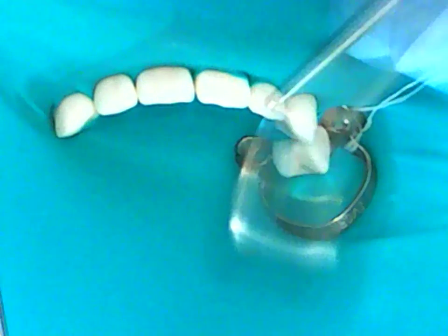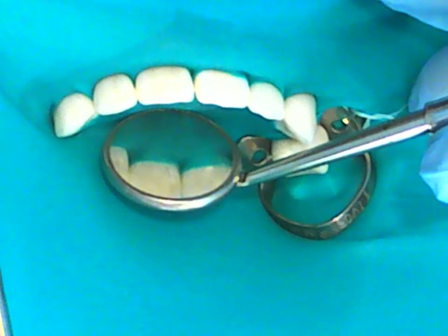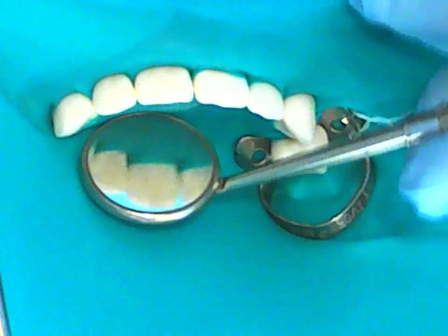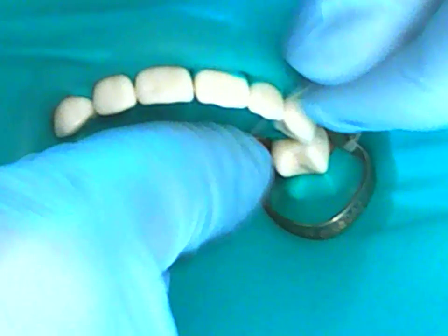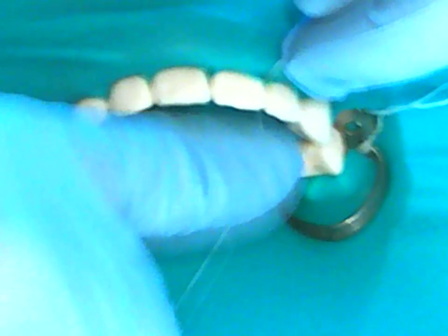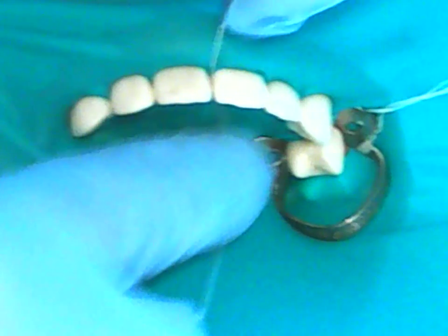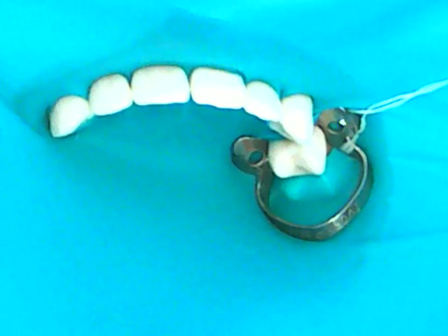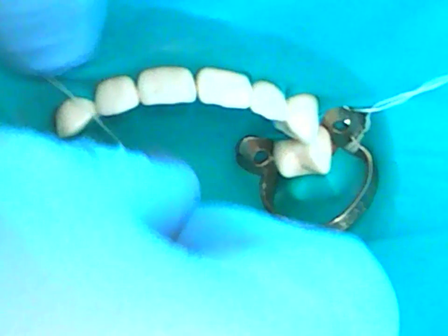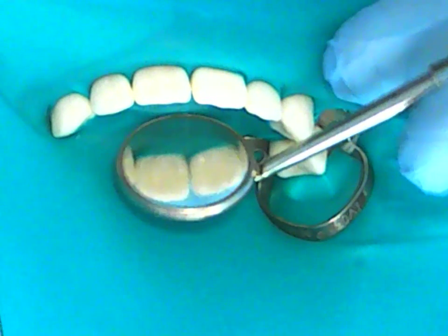I always like to check the lingual aspects, and because, like I said, it's tricky, we can see the facial but not the lingual. What I saw with this is that there's still quite a bit of dental dam rising up on the back of those teeth. So I'm going to do it again, concentrating more on the lingual aspect. Okay, so C-shape, definitely more on the lingual is required. Okay, that is better.